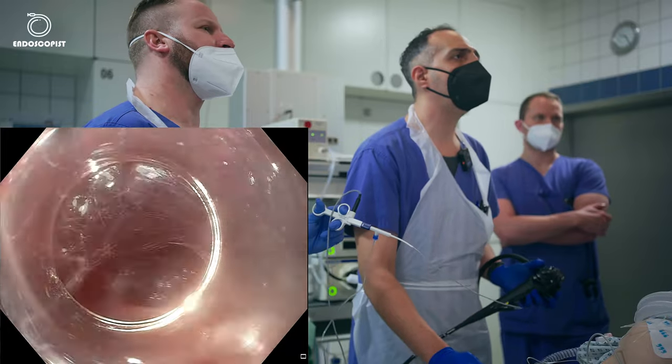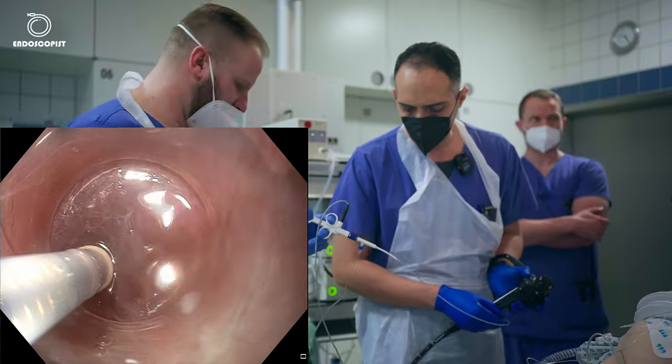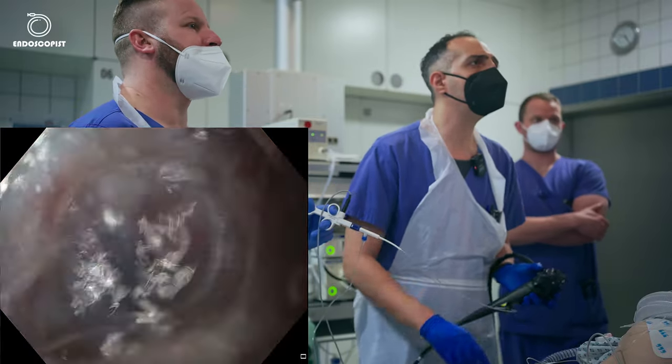So the cardia is the most tricky part during the tunnel. And if a perforation will occur, it will occur at this area. So I'll try to be extra cautious.